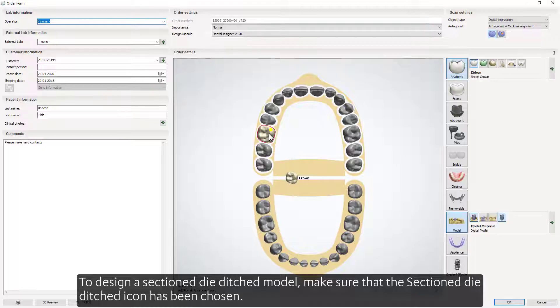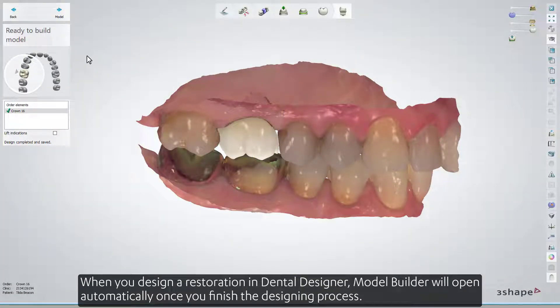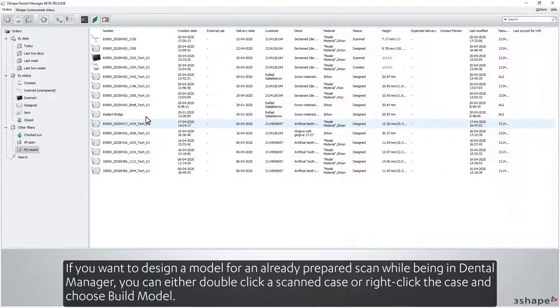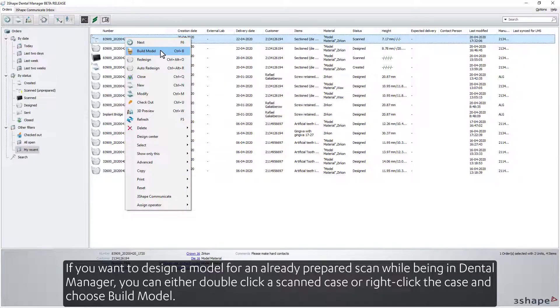To design a sectioned die-ditched model, make sure that the sectioned die-ditched icon has been chosen. When you design a restoration in Dental Designer, Model Builder will open automatically once you finish the designing process — simply click Model while at the Save step. If you want to design a model for an already prepared scan while being in Dental Manager, you can either double-click on a scanned case, or right-click the case and choose Build Model.